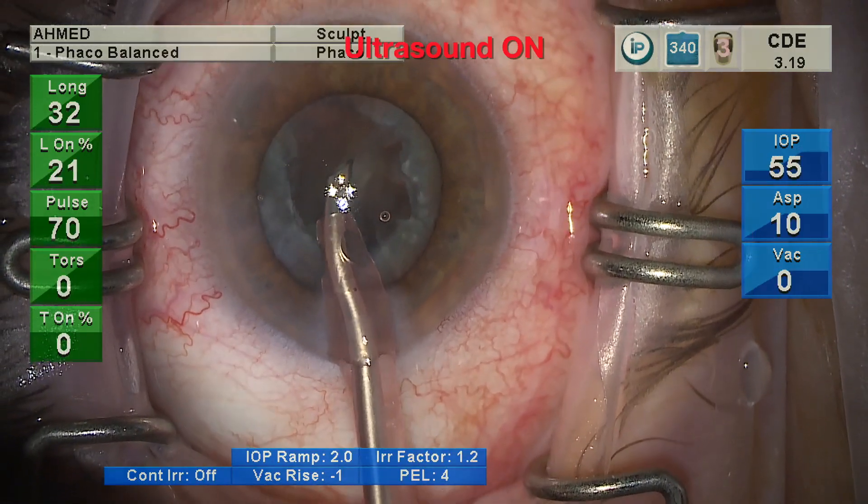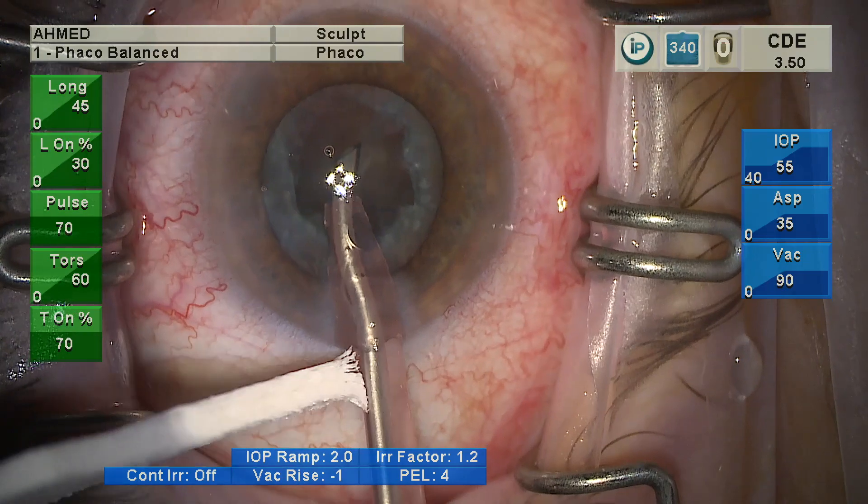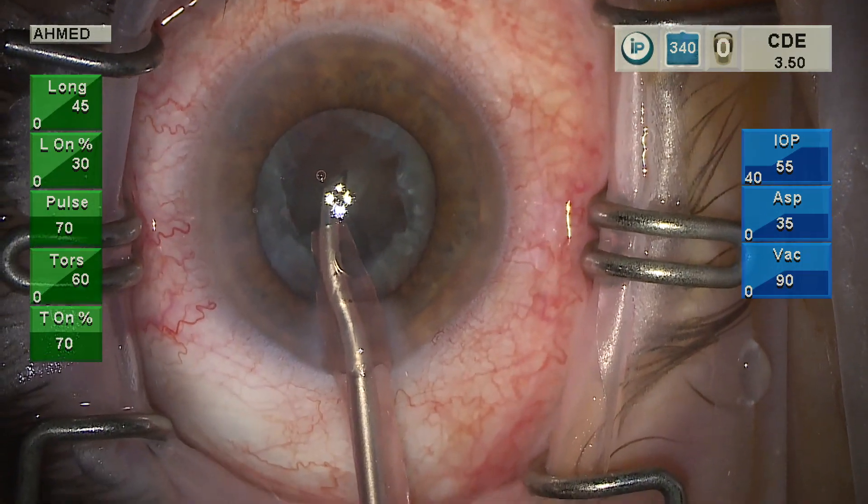So I think this small in vivo example using phacoemulsification — both longitudinal and torsional — does not appear to show any obvious evidence of aerosol generation outside the eye.